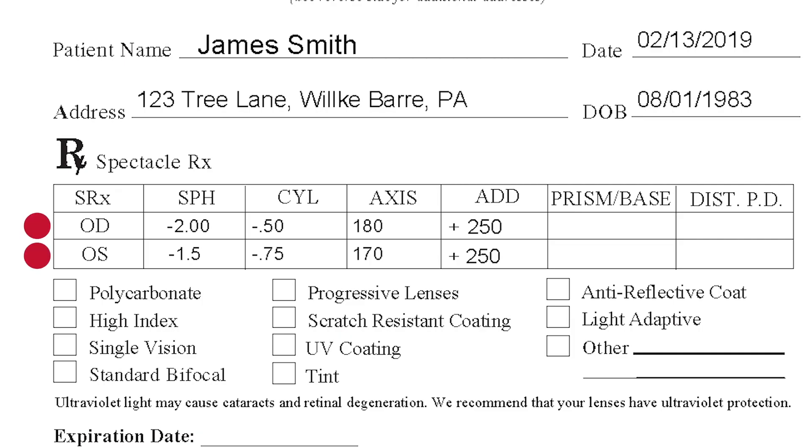See these letters O-D and O-S? They're Latin terms for your right eye and left eye. If you see O-U on the prescription, that refers to both of your eyes.